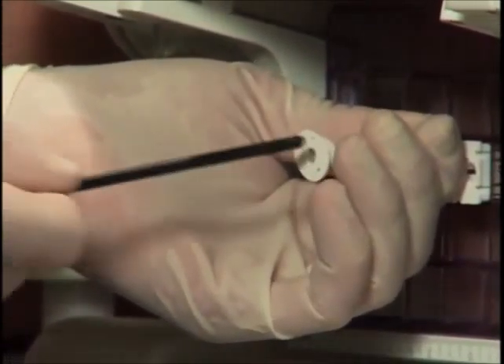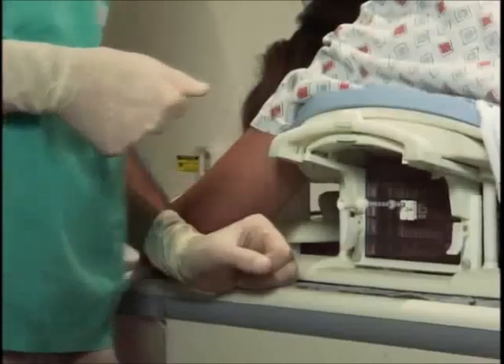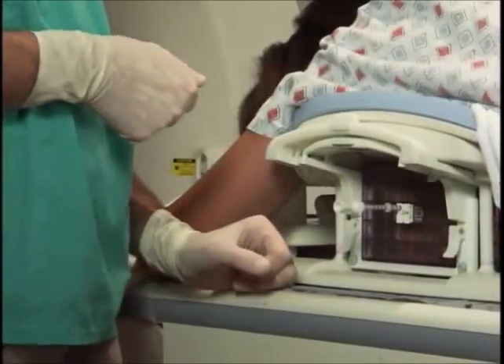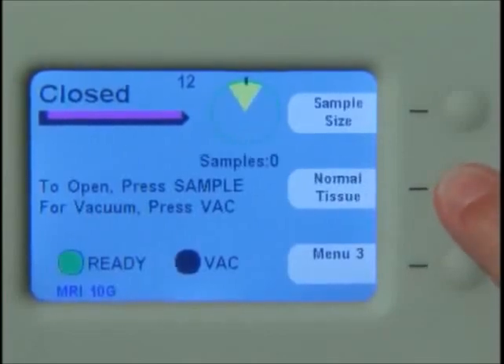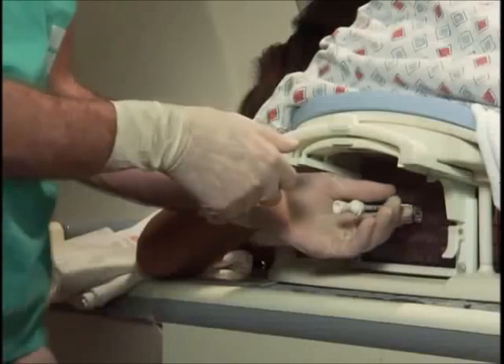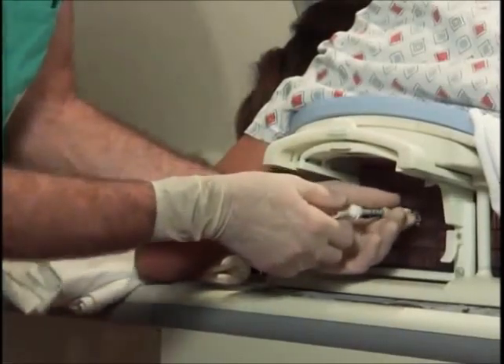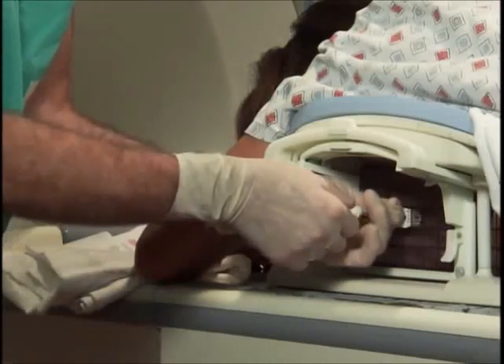You then replace the trocar with an obturator. Having confirmed the appropriate positioning of your obturator, inform your technologist of the positions you wish to biopsy and the settings to place on the Centerex console. While that is being performed, return to the suite and remove the obturator, pinching the sheath flush with the block to avoid any movement of the sheath.